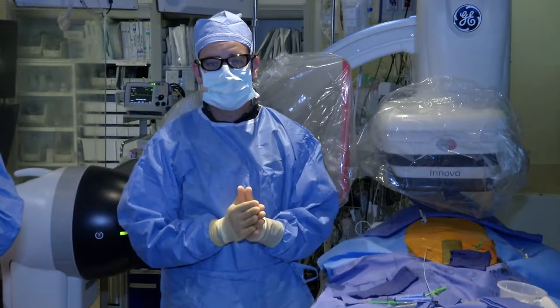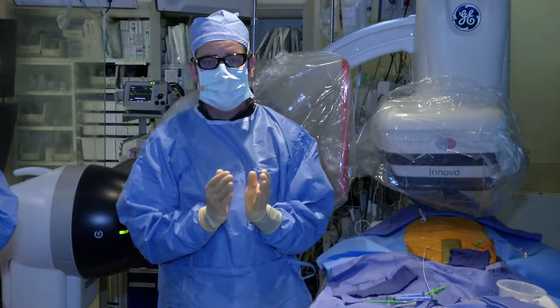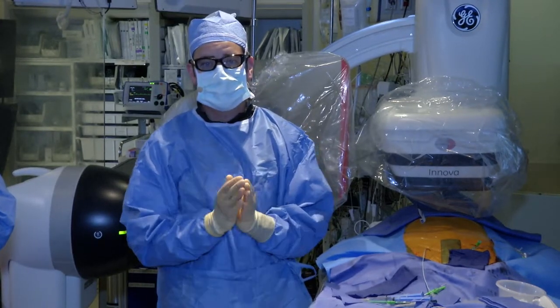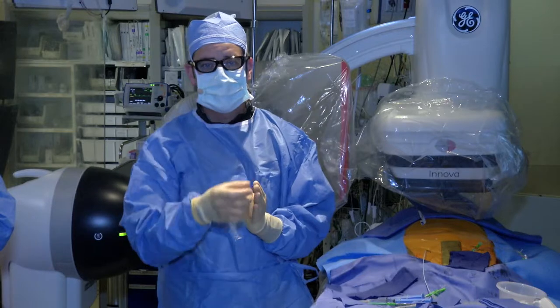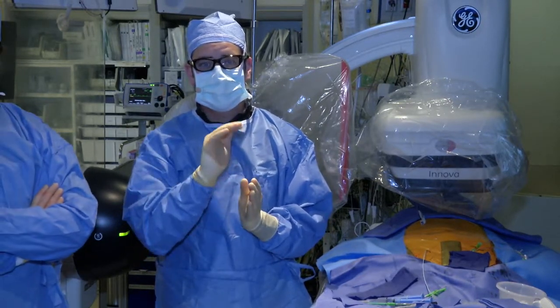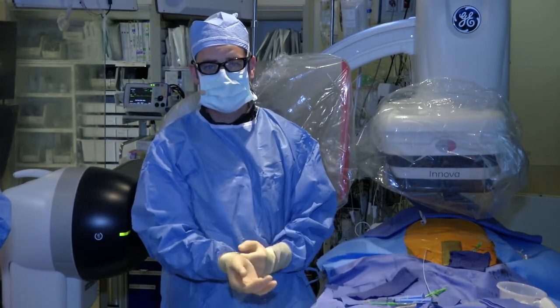And the reason why we pace the heart quickly is just like any pump. If a pump goes very, very fast, it cavitates and it doesn't circulate fluid. We want that to happen because if the heart is pumping too strongly, it's pushing blood out and the valve can migrate like a champagne cork. So we want to actually overdrive pace the heart so it cavitates, reduces the amount of flow across the valve so we can get the valve in position. So that's the purpose of the temporary pacemaker.